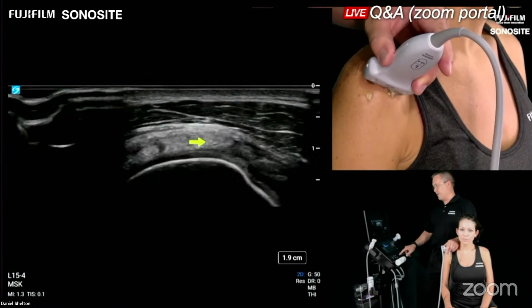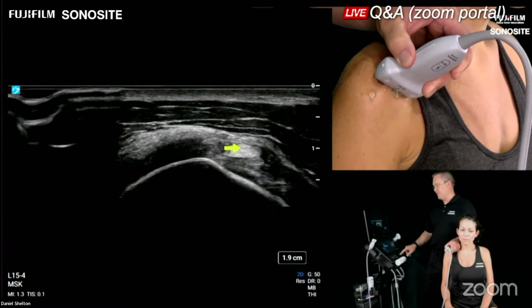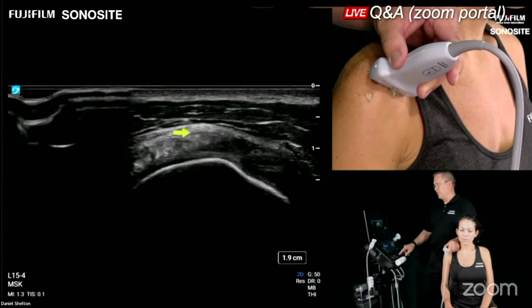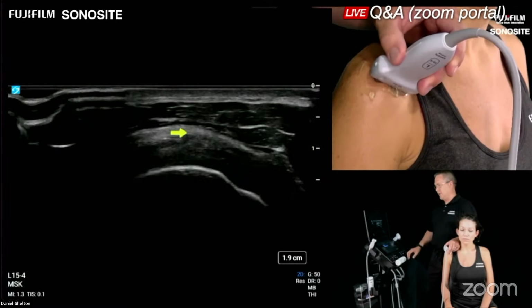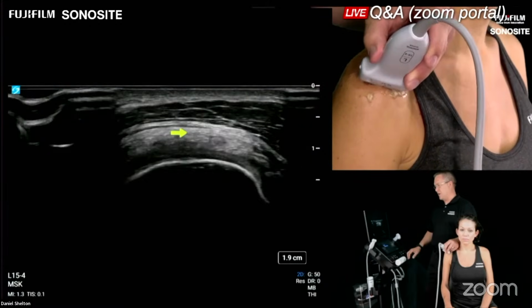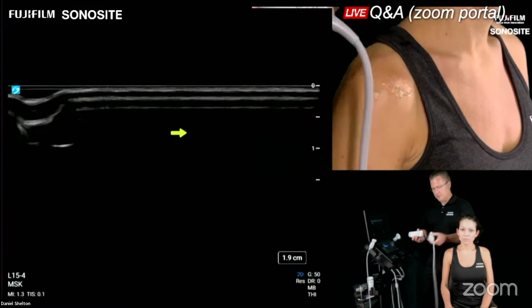We're going to be looking for subtle pathology here, in this case a normal exam. Here's our biceps here as our anterior landmark, and then here we have our anterior supraspinatus. So before you just look at the book or watch the video and decide that all your patients have to be stretched into that maximum level of modified CRAS and putting any stress on the tendon, just keep in mind you can see a whole lot of anatomy just without stressing your patient's positioning.